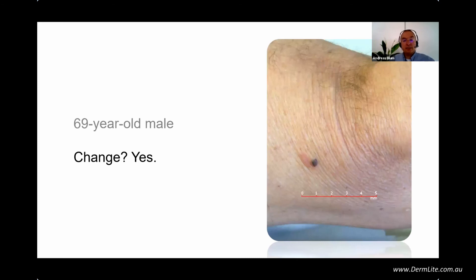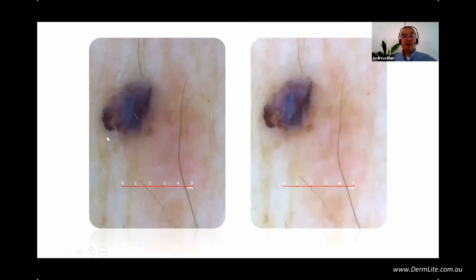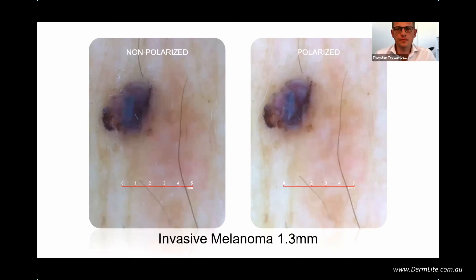Next patient, and here I want to show you a little trick. 69-year-old with a change at his knee. With non-polarization: atypical eccentric hyperpigmentation, bluish, grayish, a little bit of Milky Way, and some pseudopods — you know this must be malignant. With polarization light, very distinct clear white lines appear. You know exactly this must be melanoma — and it was an invasive melanoma. Now I'll show you the toggle trick.